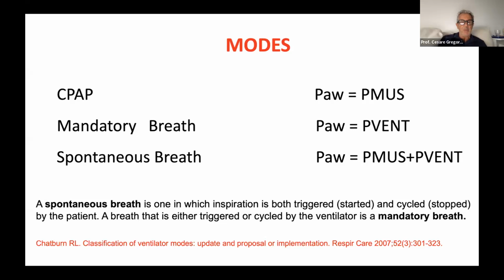At the same time, we can define a spontaneous breath. This is the one in which inspiration is both triggered, that means started, and cycled, stopped, by the patient. Instead, a breath that is either triggered or cycled by the ventilator is called a mandatory breath.